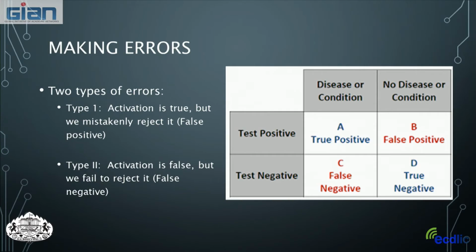Okay, so there's another problem of doing this. The problem is that we might have 64 voxels by 64 voxels over 30 slices of data. So we're actually doing thousands of t-tests, and we're assuming that each voxel is working independently of the others.